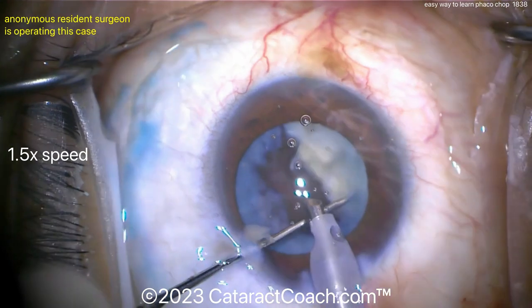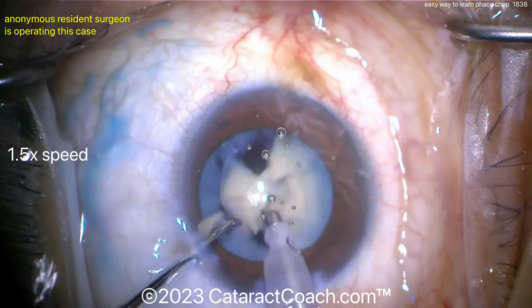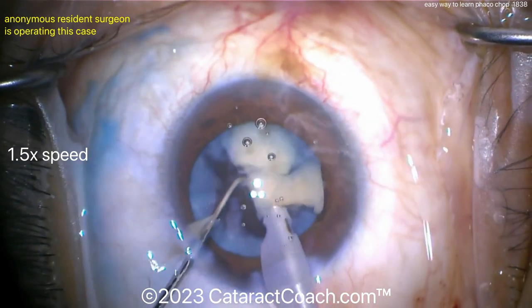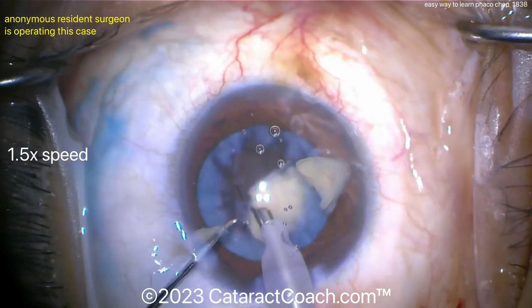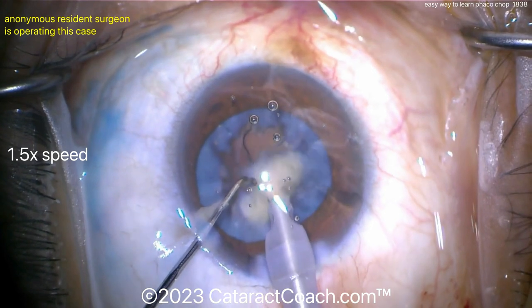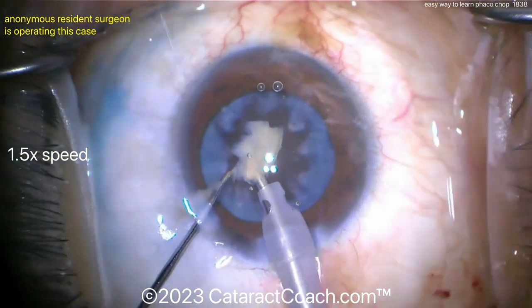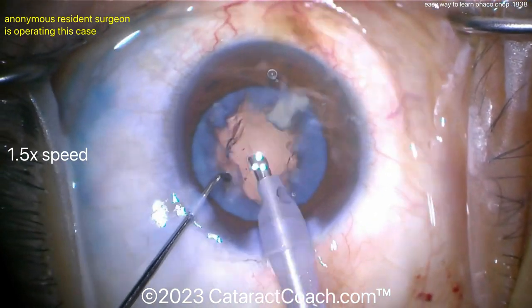Bringing the pieces up — nice chop. This is the way you can learn the chop: do your divide and conquer still, bring each quadrant up to the iris plane, use a chopper and chop it. Even if the chop fails, it doesn't matter — you can just emulsify that one quadrant like you would have anyway. Here's the last quadrant; it can just be emulsified down. Nicely done, young resident — keep up the good work. Remember, you still have to transition to full-on chop, and then you're going to have a very nice outcome for this case.